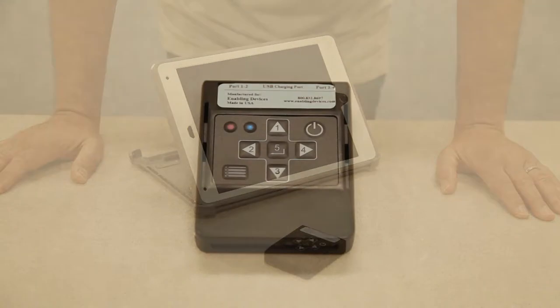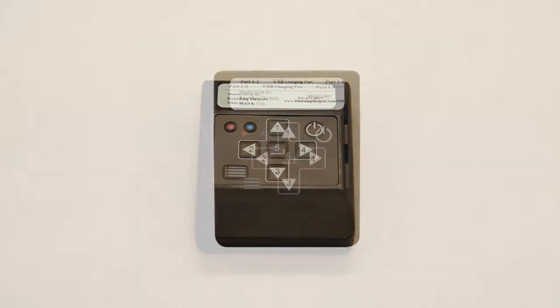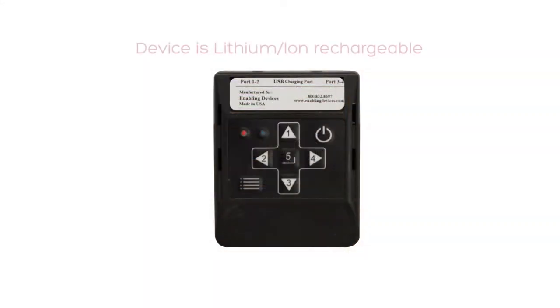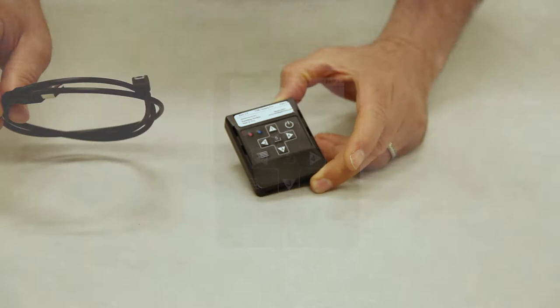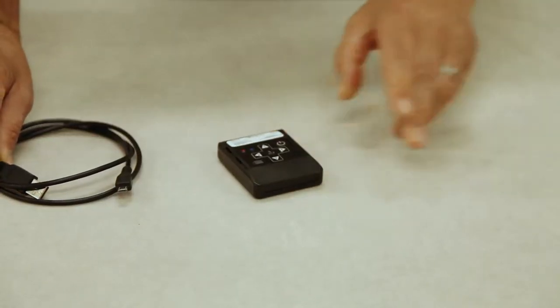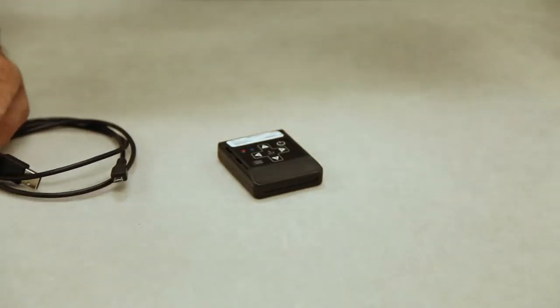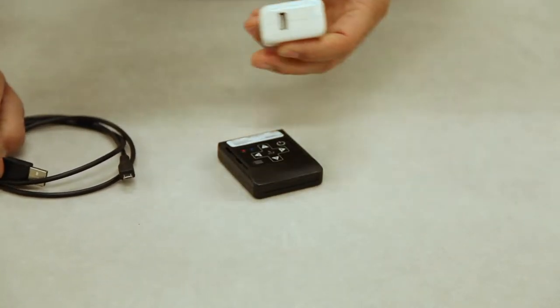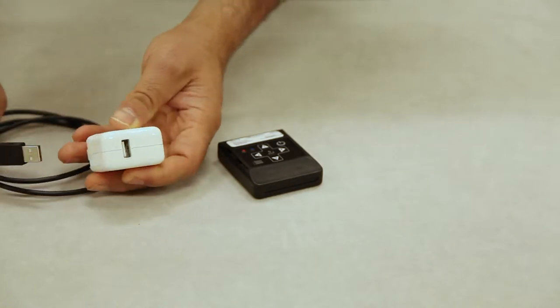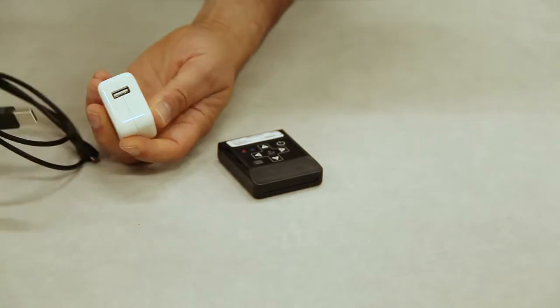Before we get started, I want to show you a quick overview of the interface, all the controls and the ports. This is a lithium-ion rechargeable device so there's no batteries required. You charge this with the included micro USB charging cable and you can use that with any USB charging adapter such as what your iPad comes with.